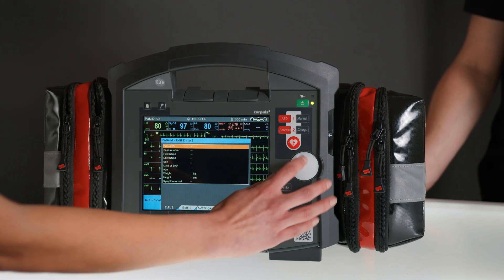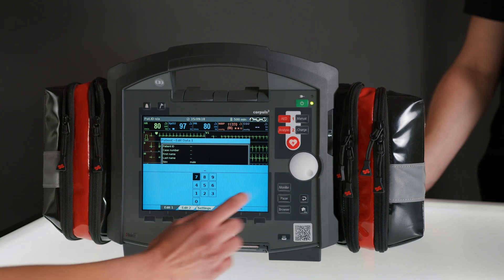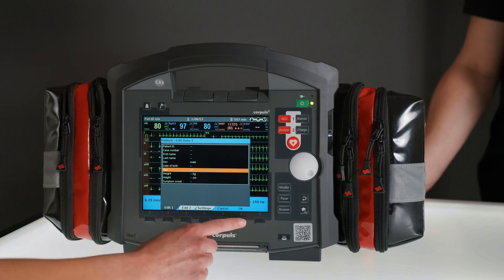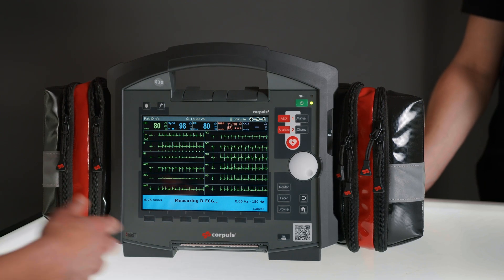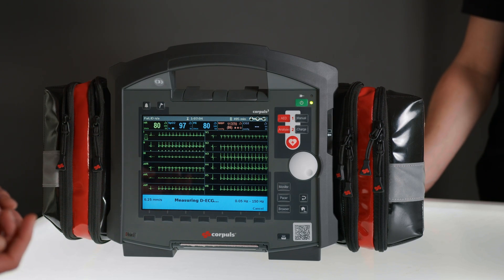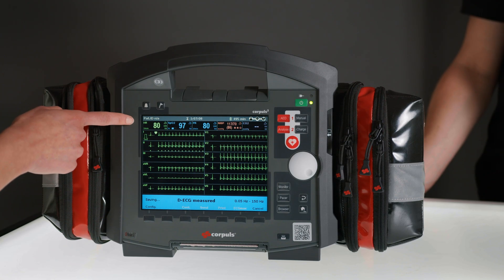In this case, this is a male patient, age 37. I can now confirm everything again with OK. Now the ECG will be measured. The patient can still be monitored during this time as the vital parameters are still displayed in real time.